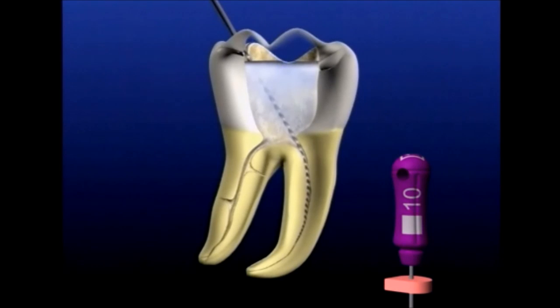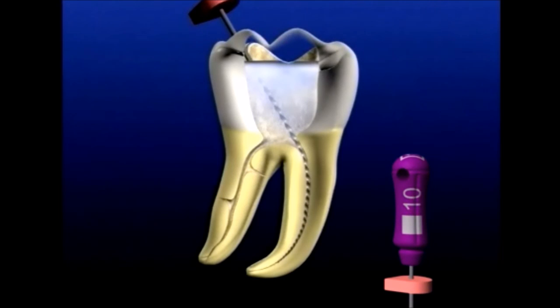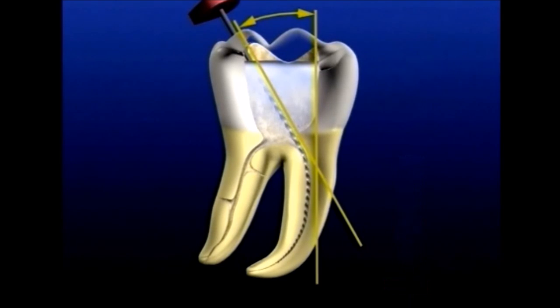When it's snug, we pull, and importantly, we're cutting on the outstroke, away from the terminus, and out of the canal. Generally, about 6 feed-in pull cutting cycles achieves a smooth and reproducible glide path. When scouting the coronal two-thirds of a canal, clinicians need to be aware of the handle as it relates to the long axis of the canal.